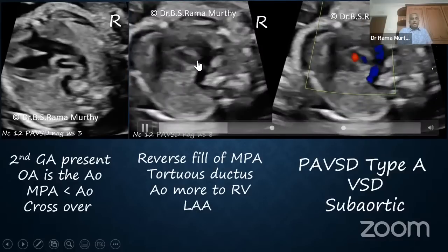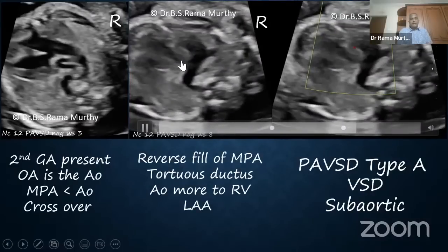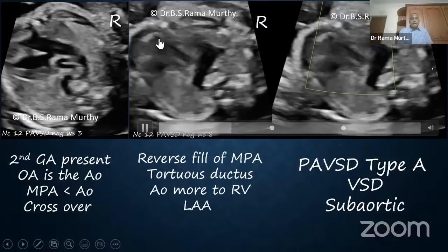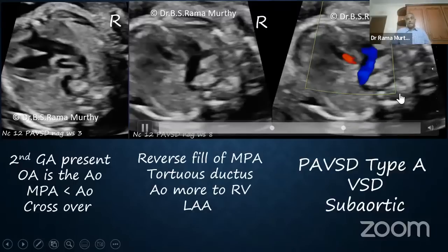And you see that there is a second artery, which is coming from the ventricle. So the great artery is there. A second great artery is there, and it is much, much narrower, trying to come from the right ventricle. But when I turn the color Doppler on, here is the surprise.